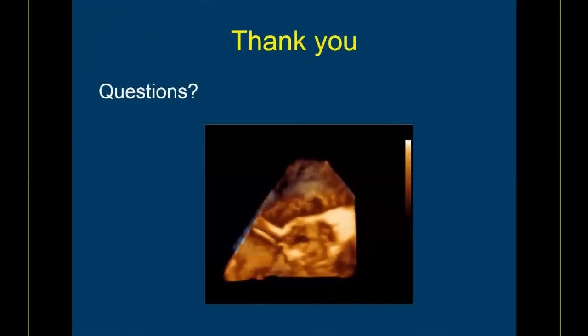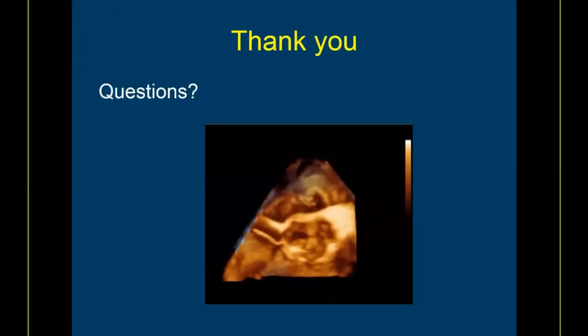One of the questions is, should we calculate stroke volume index in all patients or only severe aortic stenosis? The stroke volume index really is a subgroup of severe aortic stenosis, so I would reserve it for aortic stenosis. We have plenty of calculations to do already. That's what we've been using it for, when we calculate an AVA less than 1.0.